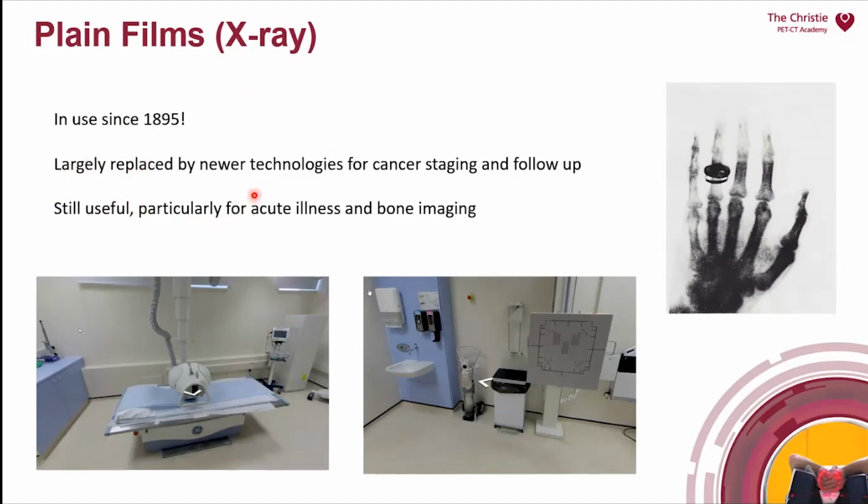So for acute illnesses such as chest infections, and particularly for bone imaging, there's still nothing that really replaces the detail you get of bones with plain films. So they're still used, and a lot of people will still experience having these.